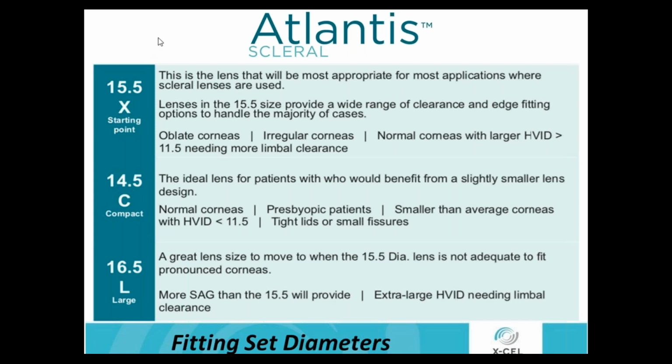We have 200,000 lenses on eye, and 15.0 made up 86% of those lenses. So 86% of the time when we put a 15.0 millimeter lens on, we could fit that patient. And just now we've gone to a 15.5 standard diameter. Just going up 0.5 millimeter, we have increased that fitting percentage from 86% to 96. It's between 96 and 97% of the patients that we see now that are fit in the 15.5. So our starting point is a 15.5 diameter.